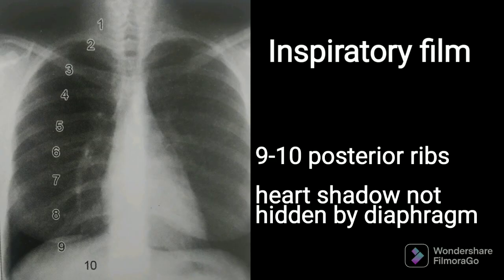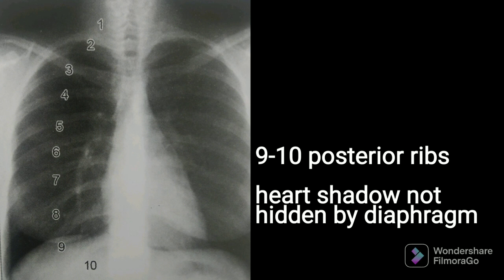Talking about an inspiratory film: we have 9 to 10 posterior ribs which will be easily visible, and the heart shadow is not hidden behind the diaphragm. These two are the features of an inspiratory film.